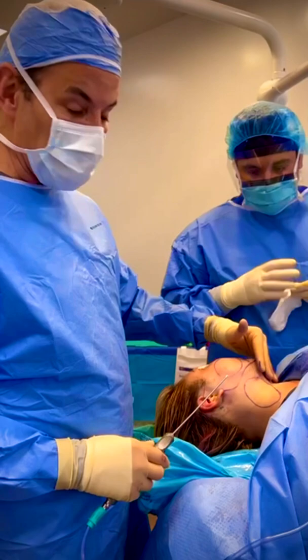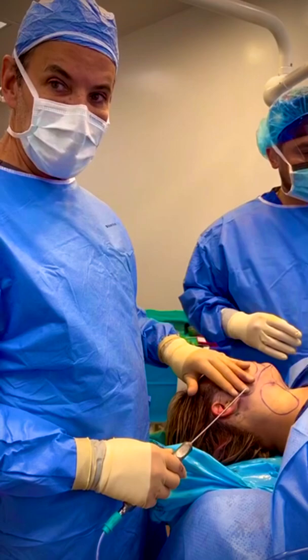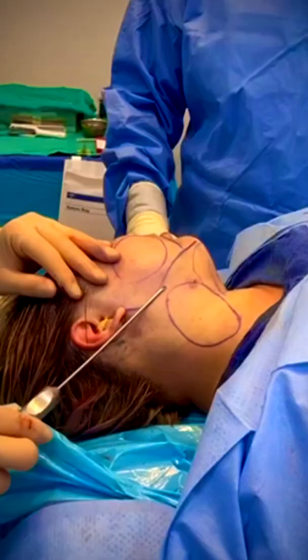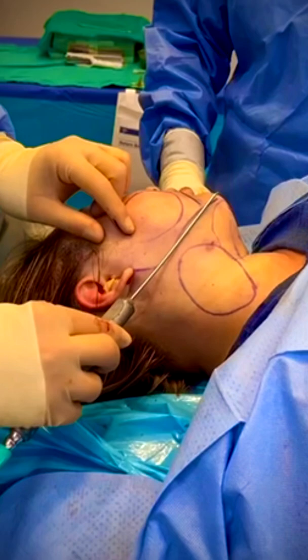So we're done with the laser. You can see the swelling — a lot of it's already gone down because she's absorbed some of the fluid, and the heat from the laser also vaporizes some of the fluid. And now we're going to do liposuction. The liposuction will be everywhere sort of under the jawline — we want to give her that snatched jawline, so we're going to go all the way around the angle of the jaw and back here by the ear, and then down here on the neck as well.